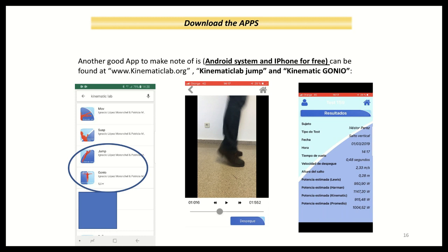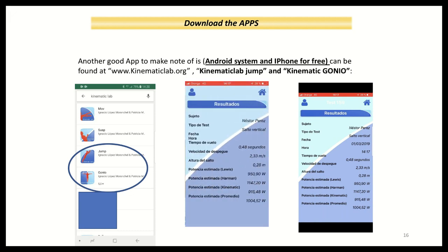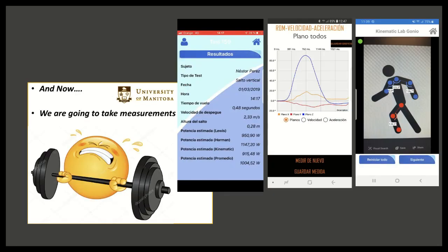Well, with both pieces of equipment we are going to find good variables that we are going to use in our patients, in the three cases that we have, okay? Well, with the three apps, we are going to take variables in three cases that tell us if we can continue working with our patient, or if we can change the treatment.